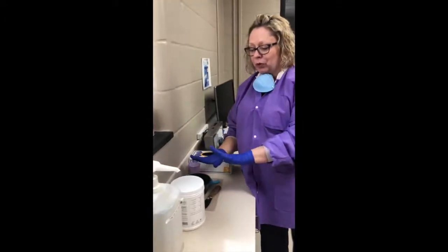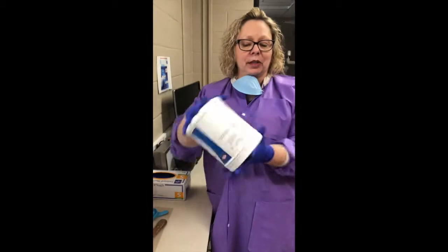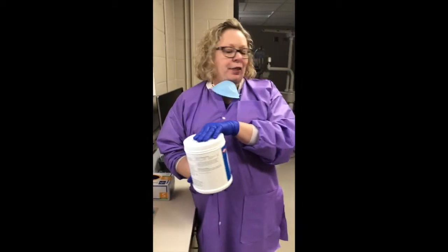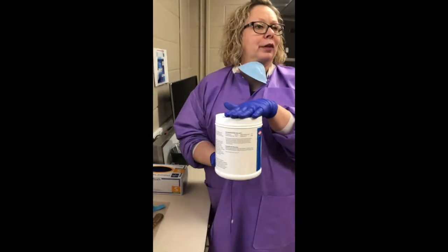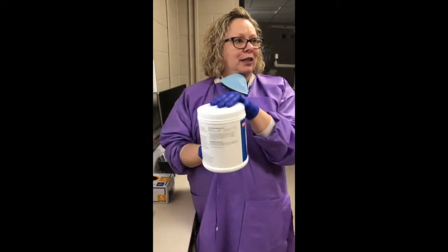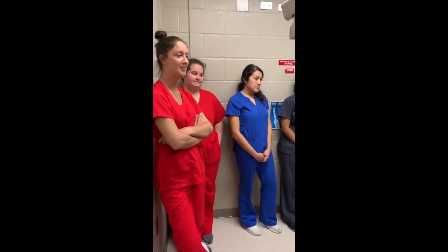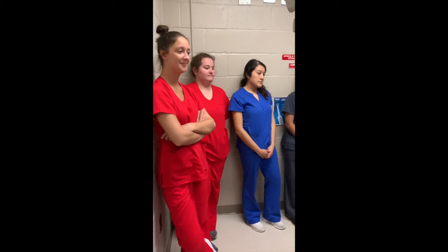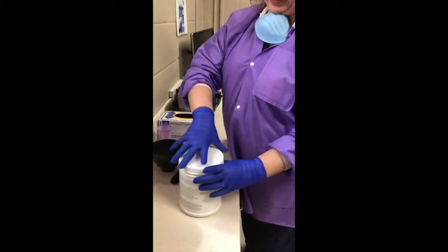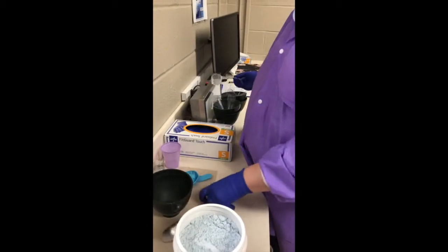So then we're going to move to our materials. This is an alginate impression material. It's a regular set material, which means you have about 30 seconds to mix it and then about a minute for it to set in the mouth. Does anybody remember why the first thing I did when I picked this up was topple it over? What does that do for us? Keeps it from settling since it's been in the cabinet. Settling in the bottom, that's right. So we fluff it a little bit by turning it upside down and right side up again. And we use a scoop to measure.